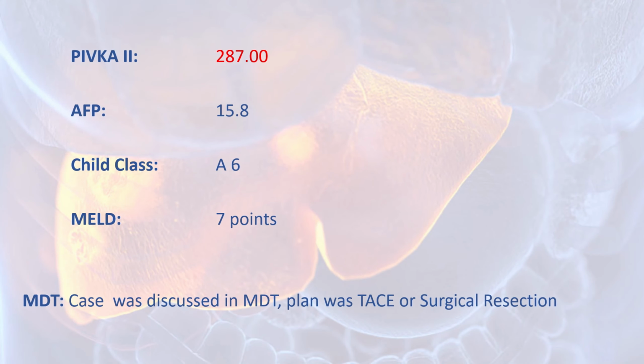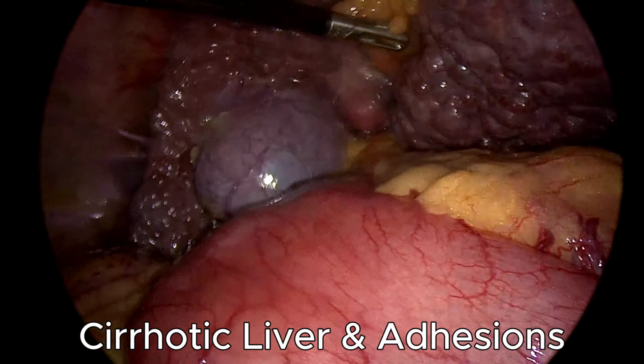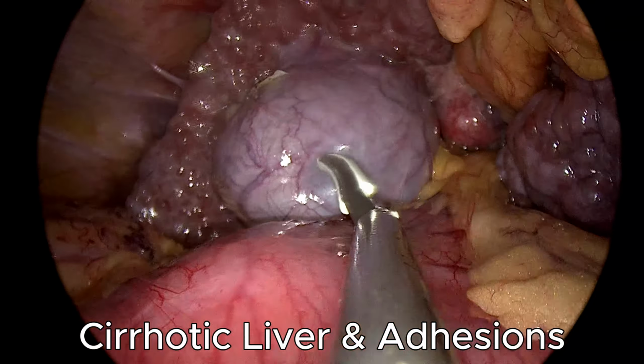Her labs are shown as follows. The case was discussed in MDT and the plan was TACE. Surgical resection or transplant were discussed with the patient and family. They opted for laparoscopic liver resection of the tumor. This is a cirrhotic liver with multiple adhesions of the liver capsule with the abdominal wall.